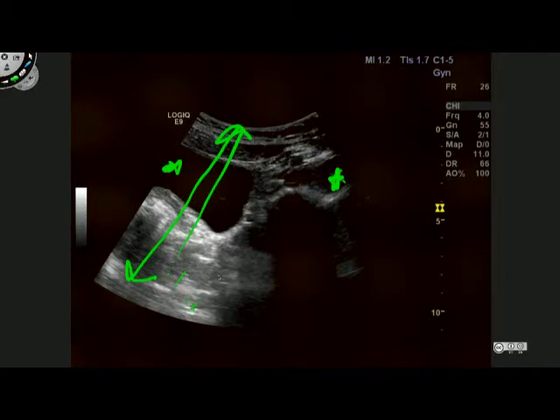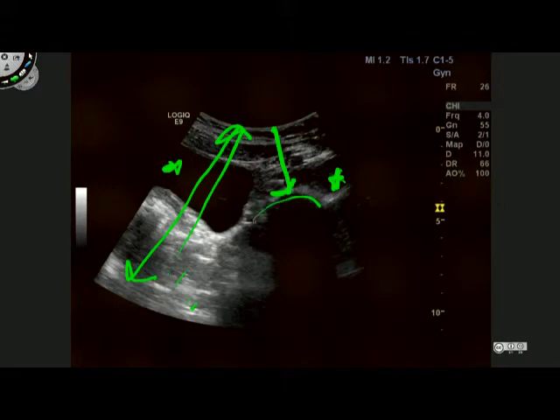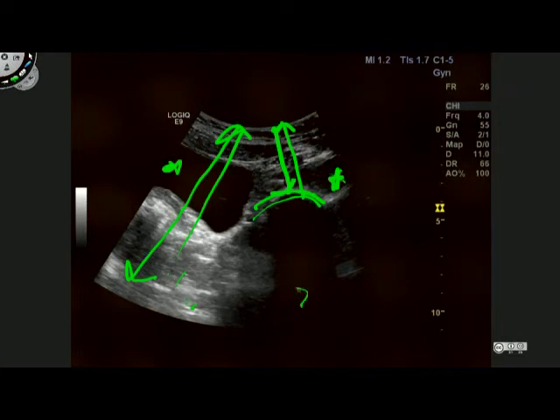However, once we come over to the left adnexa, or the left side of the lower pelvis, you see that the sound waves come down but this time it meets with this very, very high reflector from gas within the bowel and is reflected straight back to the transducer. So what we end up with is a very, very high signal from the reflector and no signal beyond it. So this area where there is no signal beyond it is known as posterior shadowing.